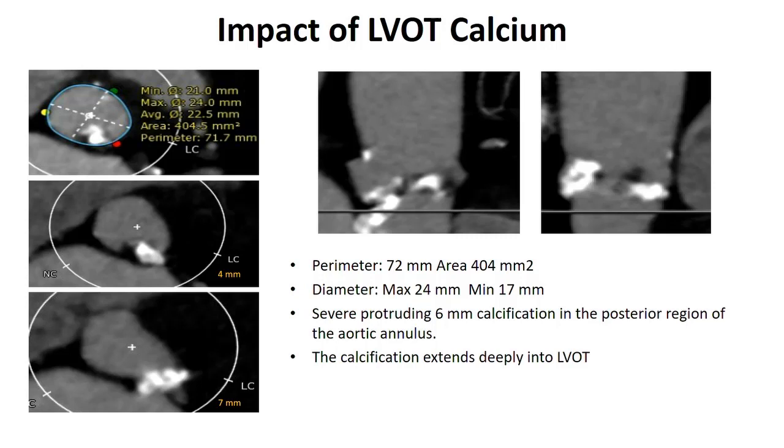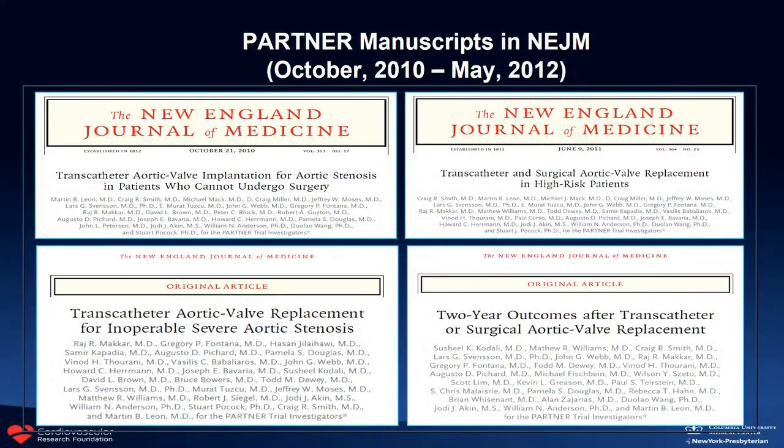Also determining what the size is. So many of the complications can be avoided just by getting the right dimensions, and this is why imaging is so critical for this technology. Now let's go to the data.